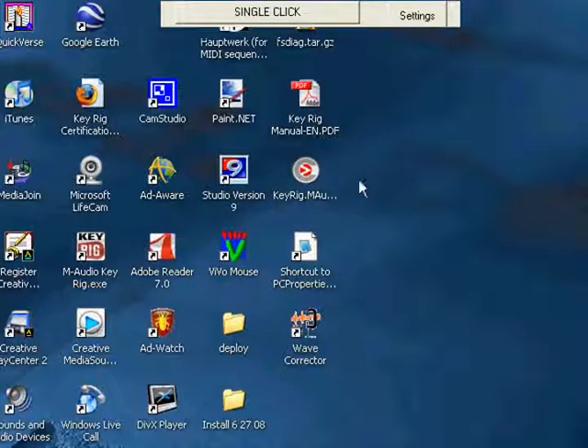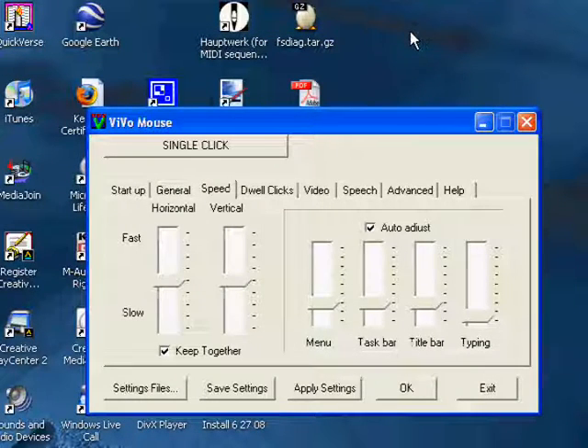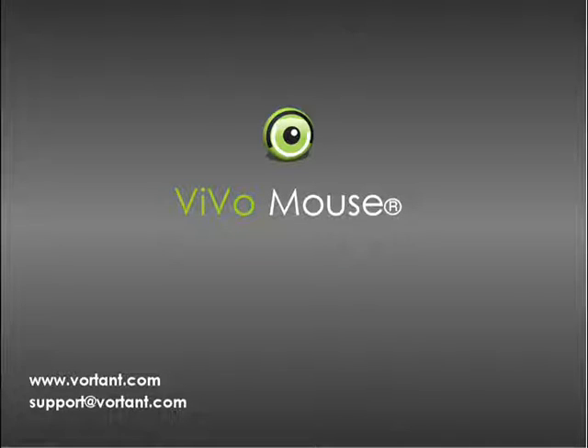If you click on the settings button of the VivoMouse control bar, the settings panel appears and you can change your settings to whatever you prefer. There are many other features of the VivoMouse that we think you will like. To try it out for yourself, please contact Vortant Technologies or one of our distributors by looking on www.vortant.com. That's the VivoMouse.